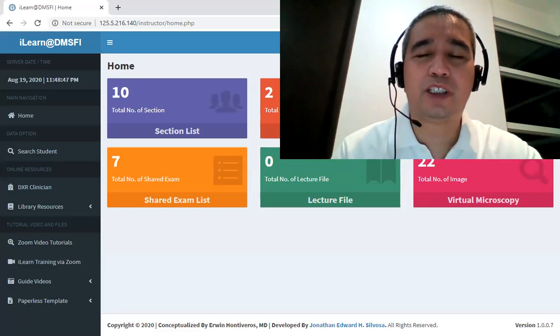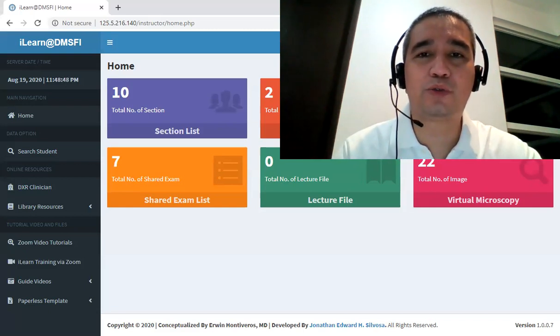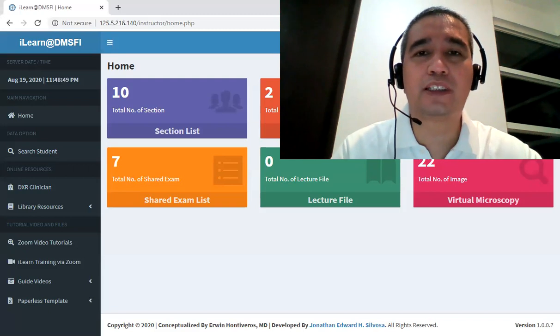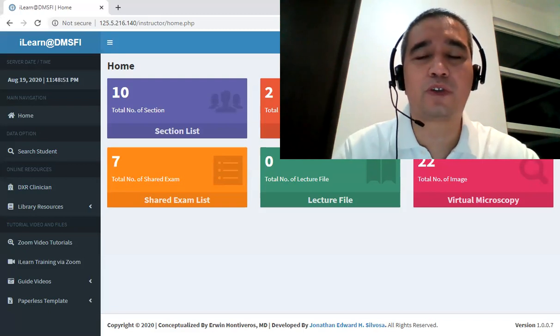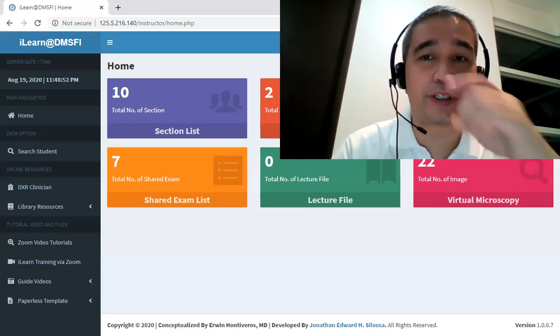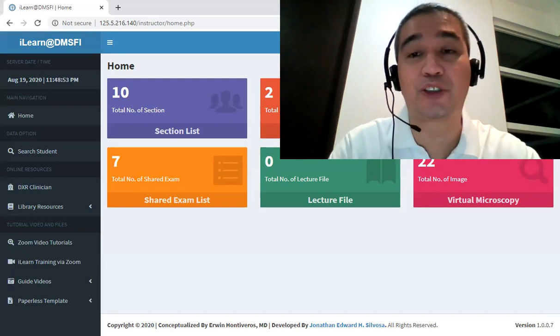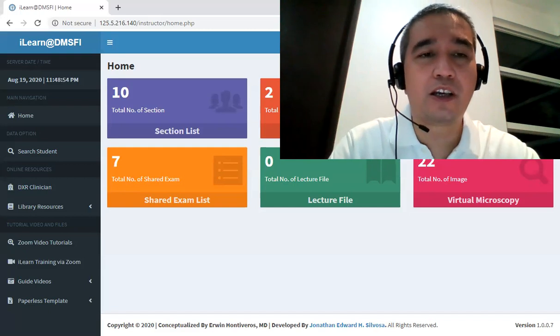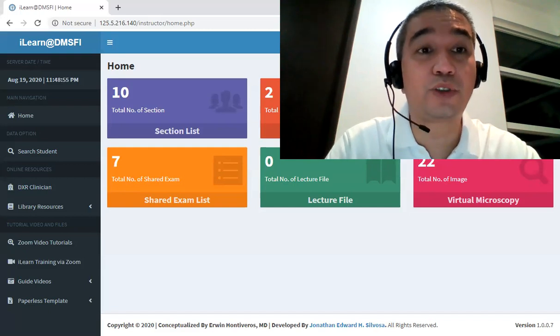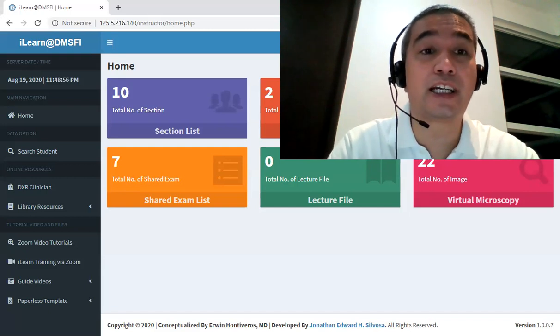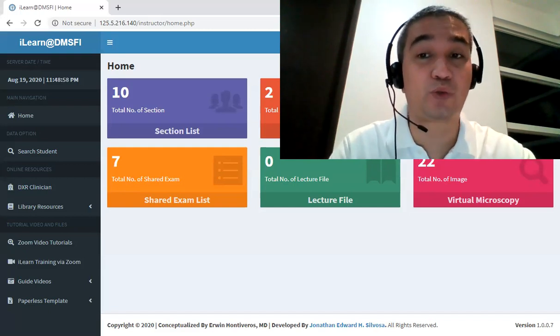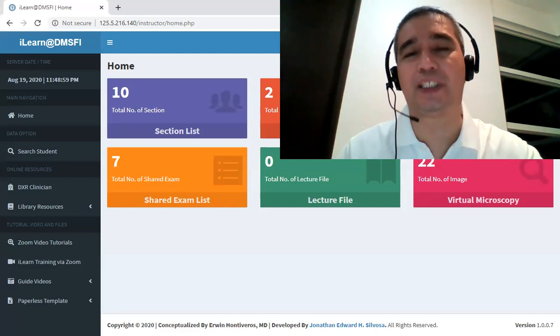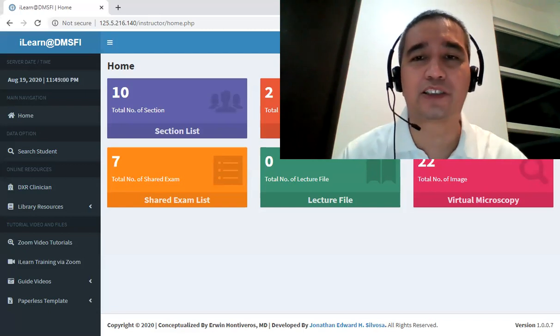So in addition to looking at the slides for this session, I'm also going to give you a tutorial on how to use the iLearn at DMSFI Virtual Microscopy. Okay, so let's start.